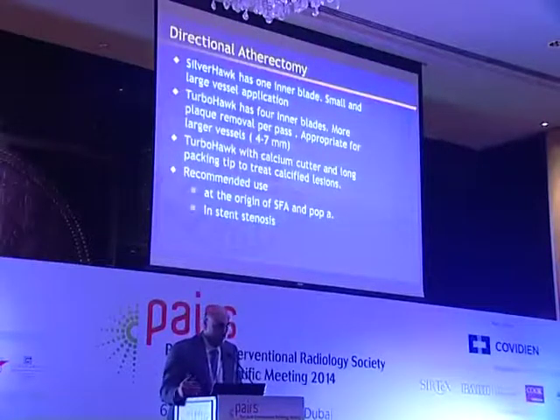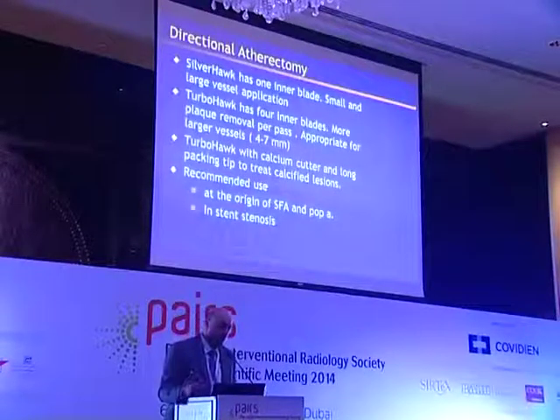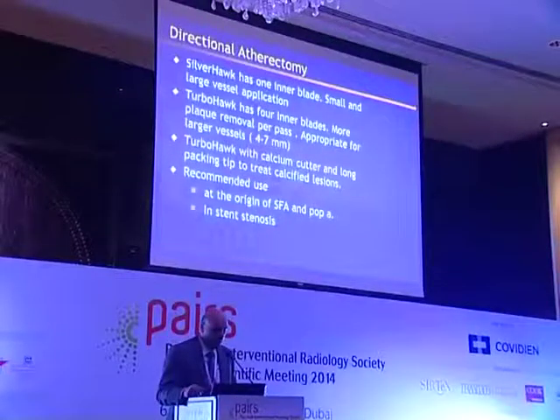There's a new calcium cutter now that is more advanced. One of the issues with this directional atherectomy was that it was not good with calcium. They have a new cutter that can actually target calcified lesions.